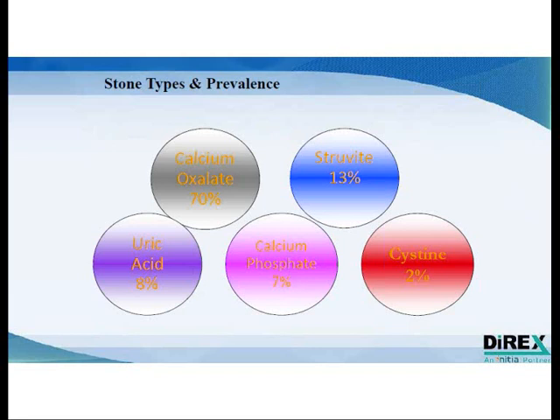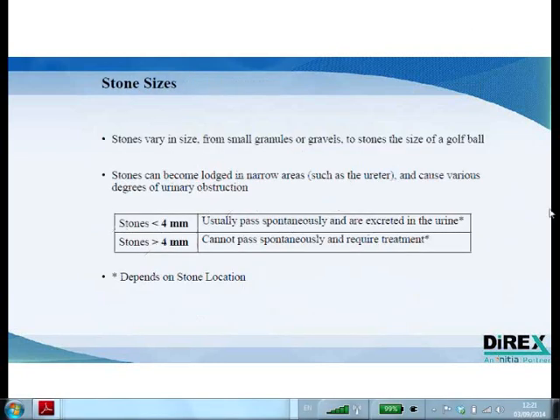Here you have an example of a uric acid stone, which is radiolucent. It cannot be seen with an X-ray, and thus the treatment of the stone will sometimes require the coupling of both X-ray and ultrasound. So the stones vary in size, anywhere from a few short millimeters, 1 to 2 millimeters, up to much larger sizes, sometimes several centimeters in diameter.